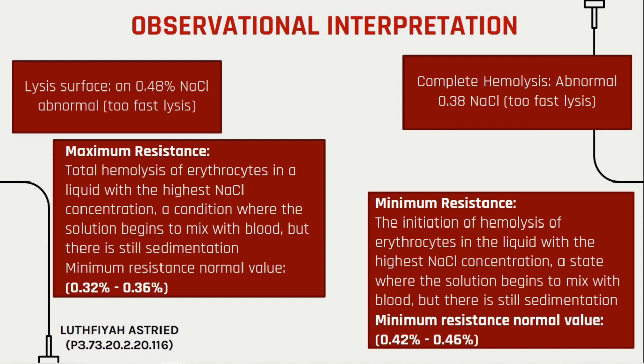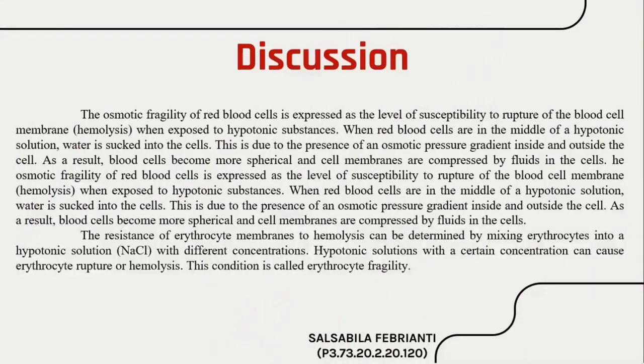Minimum resistance normal value is 0.42% to 0.46%.